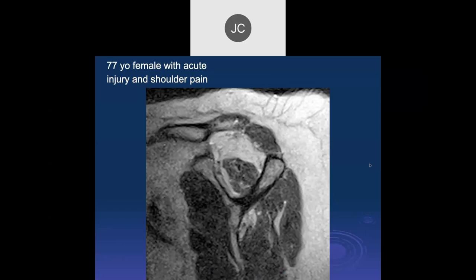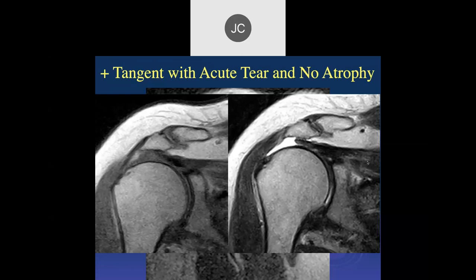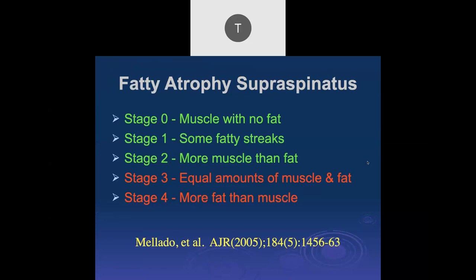A 66-year-old male with pain after acute trauma shows a positive tangent sign on sagittal view, and coronal images confirm a complete supraspinatus tear with retraction. However, the muscle itself looks very good with no real atrophy — a perfectly normal muscle despite the positive tangent sign. Similarly, a 77-year-old female with acute injury shows a full-thickness supraspinatus tear with retraction and positive tangent sign, but again without significant fatty atrophy.